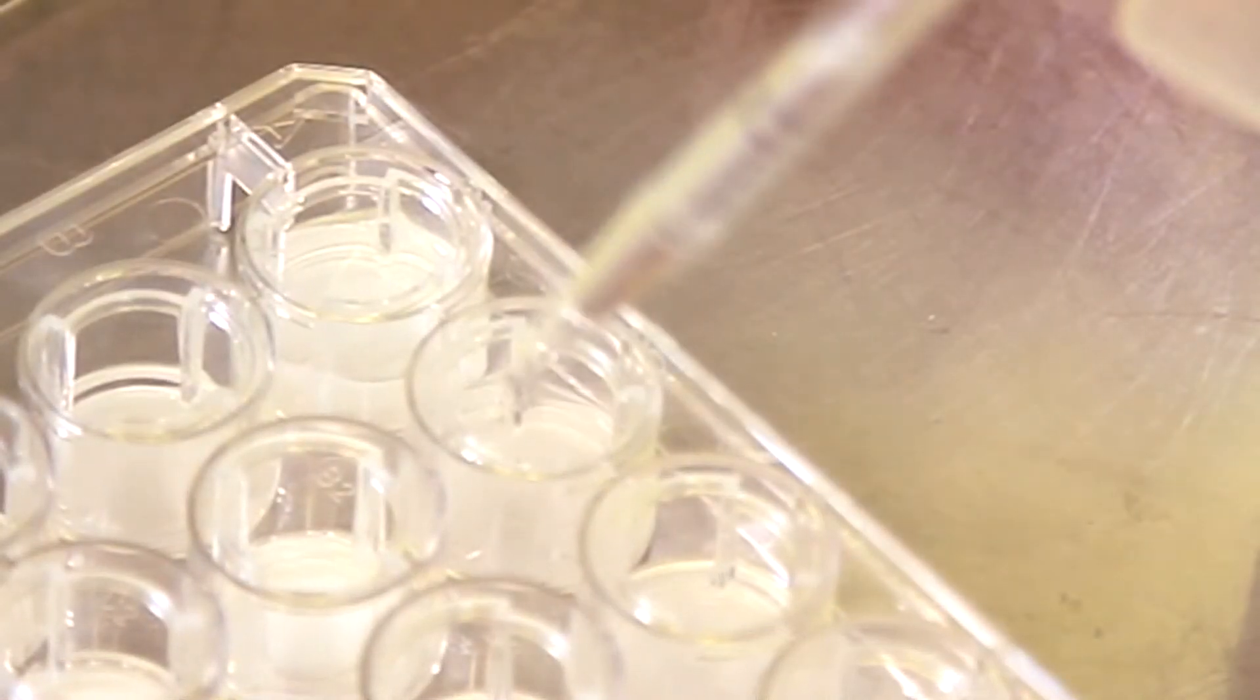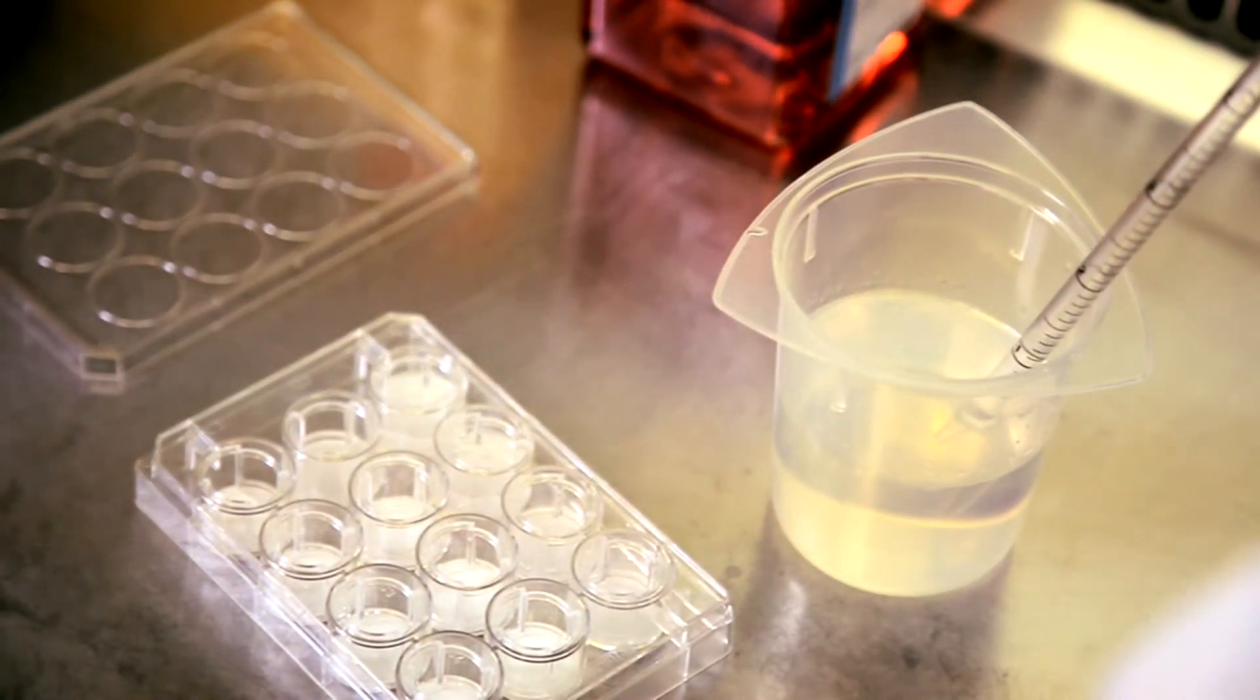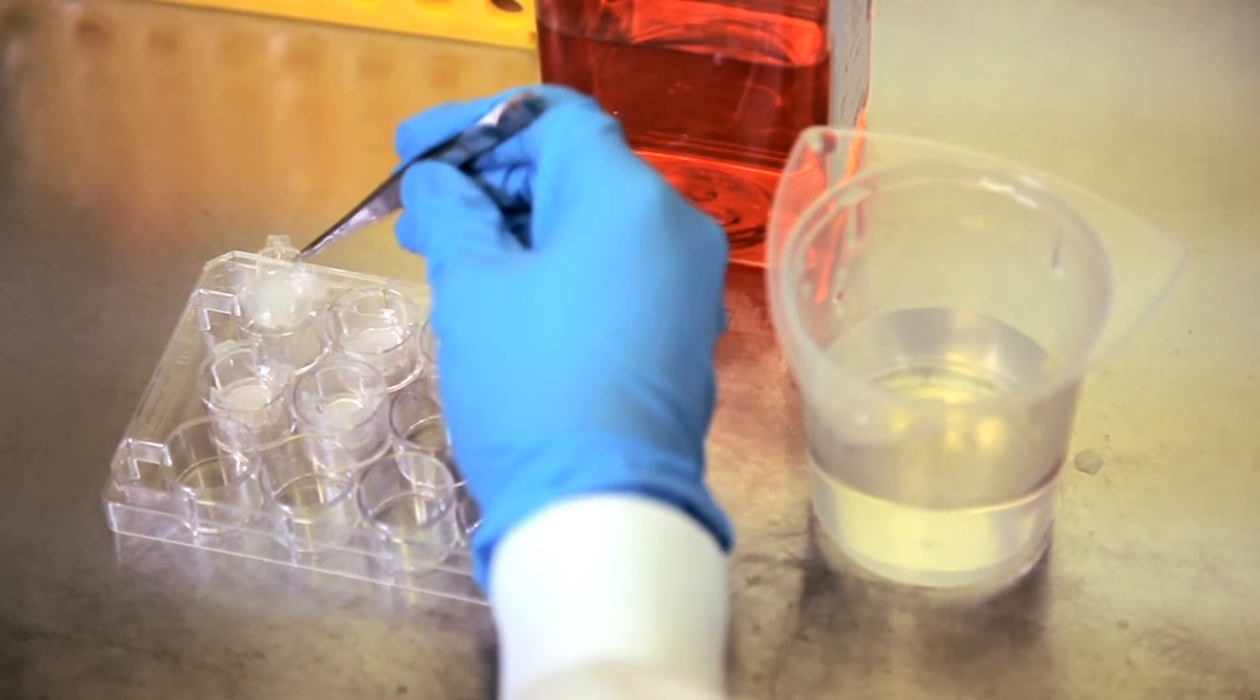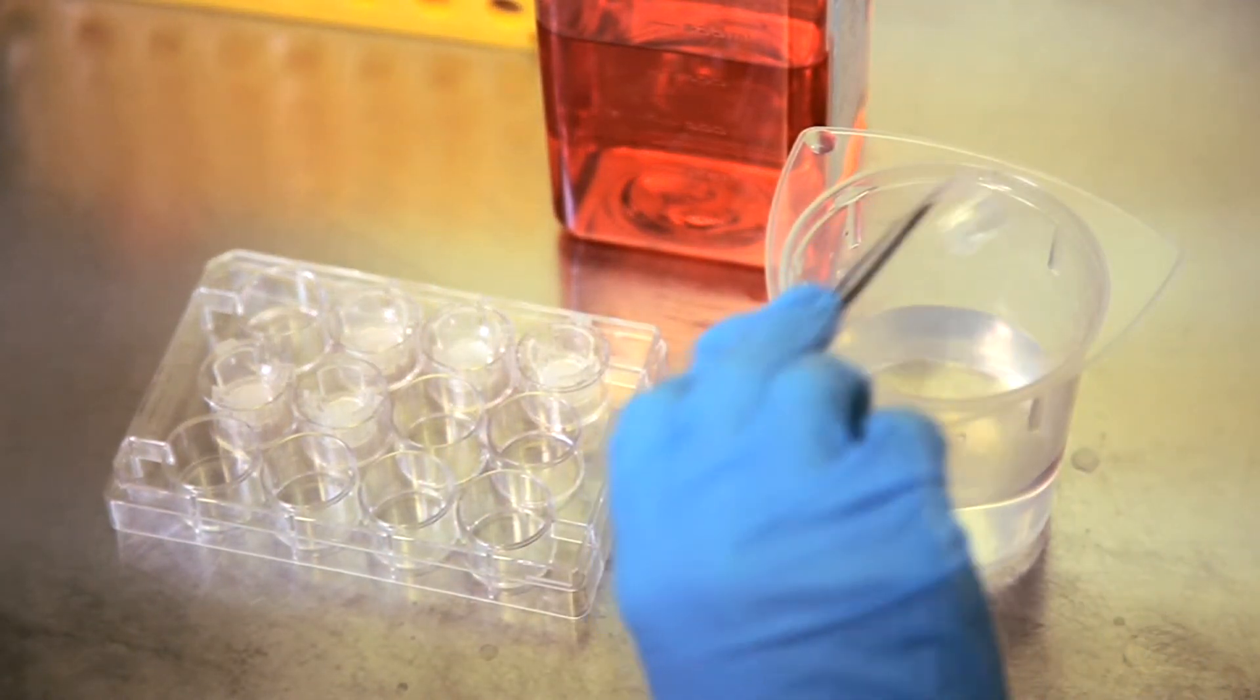When pipetting, you must ensure you add and draw solution from the side of the well so that you don't touch the Alvatex membrane. You can pre-treat well inserts by dipping them into a beaker containing ethanol before placing them in the chosen holder vessel.